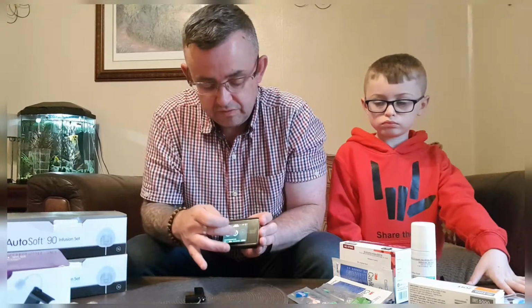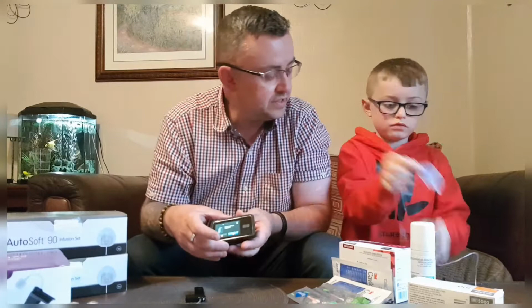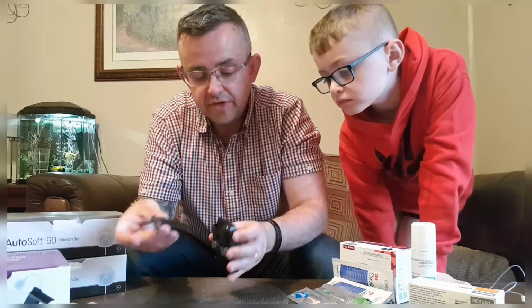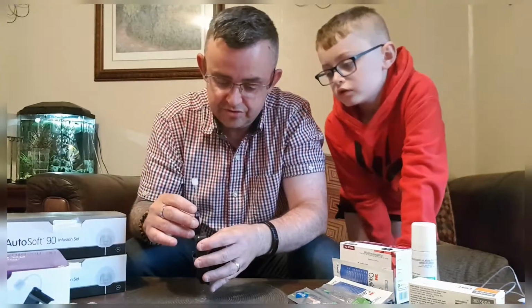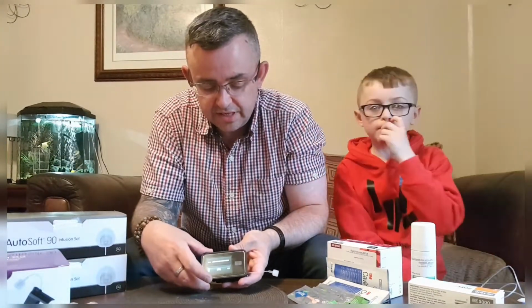So, again, one, two, three to get in the pump. Okay, so now we've done that, we need to click the unlock button. Is the cartridge inserted? Yep. The cartridge only goes in one way. You just fit it in there. They've got two guidelines, and you push it until it clicks. So, yes, we've done that. It'll now detect the cartridge.